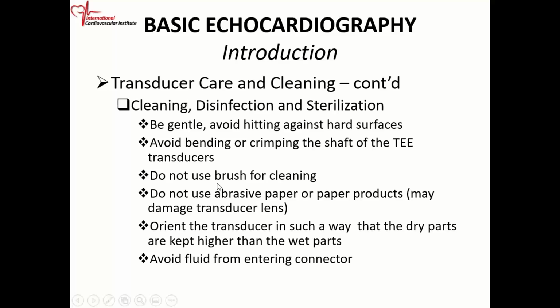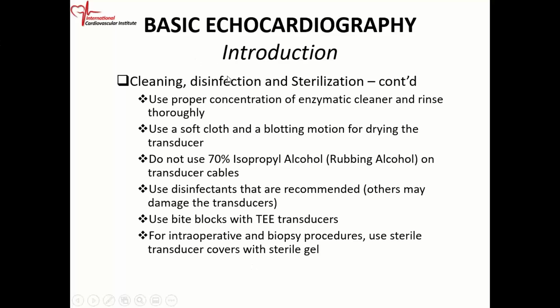Do not brush it when you're cleaning it. You shouldn't use abrasive paper. You sort of have to dampen the transesophageal probe. With the transesophageal probe, you have the gastroscope, or endoscope, that goes into the esophagus. Keep the connectors out of the cleaning solution. You don't want to get them wet, so you don't want fluid to enter the connectors. Okay, we'll show you what that looks like.